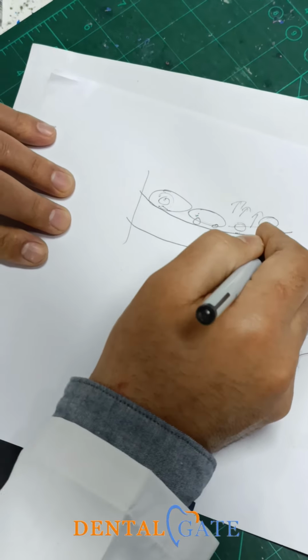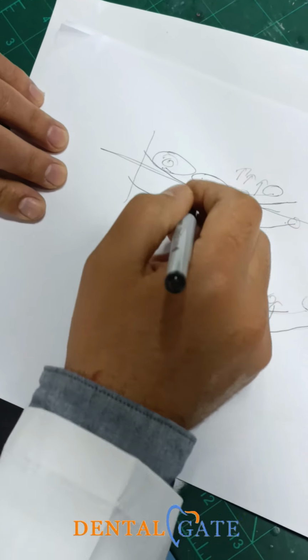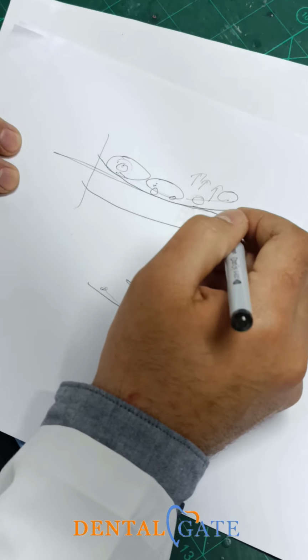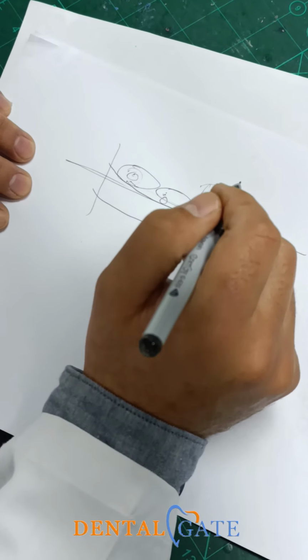When I remove my table here, I will just put the lowers according to the upper.